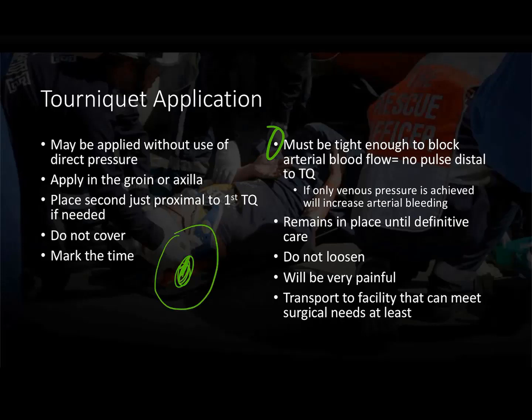Let's say that we've got the bone in the center of an extremity, and this is the outside diameter where the skin is, and we've got these blood vessels scattered throughout. Arteries are generally going to be located up against the bone or very deep in the patient's anatomy in the extremity. So when we first apply pressure through the tourniquet, it's going to apply circumferential pressure all the way around against the skin. And in that process, it starts to push down and compress blood vessels from the outside, the superficial, towards the deep, inward.